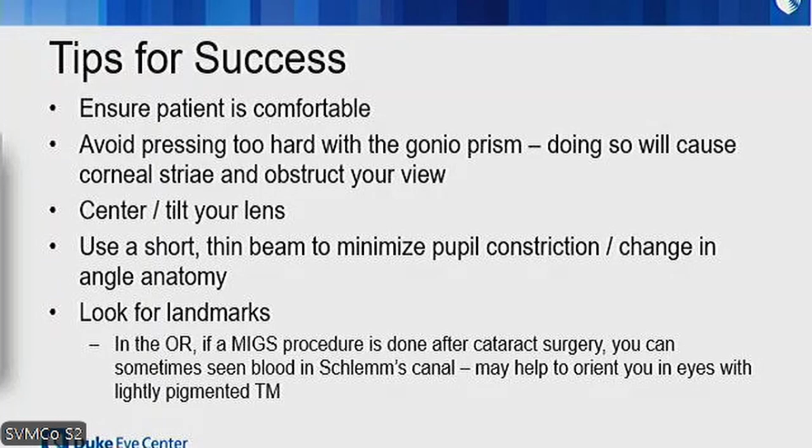In the OR, if you do MIGS, you can do it either before or after surgery. Oftentimes, if you do the MIGS after cataract surgery, the angle is wider, so you get more space. Also, if you don't have any stain like VisionBlue or trypan blue, after surgery oftentimes you can see blood in Schlemm's canal from the reflux of blood during the pressure differential during cataract surgery, and that can help you orient.